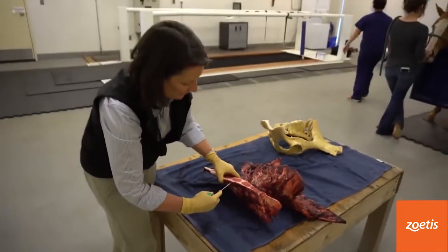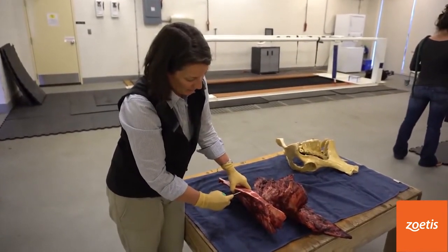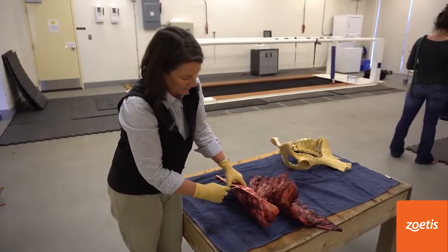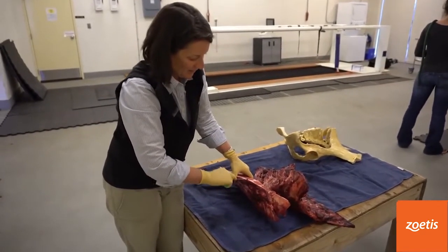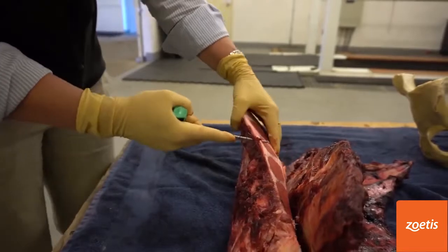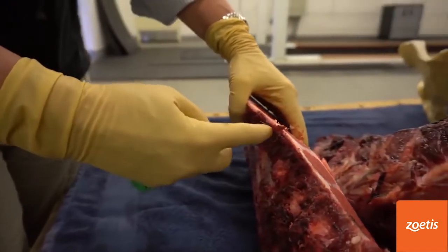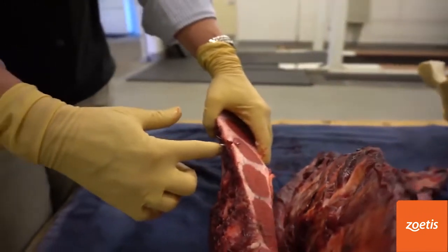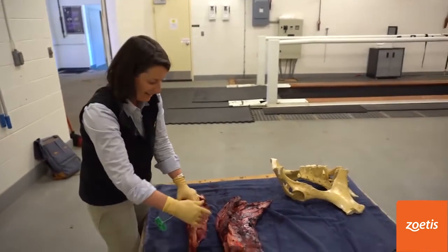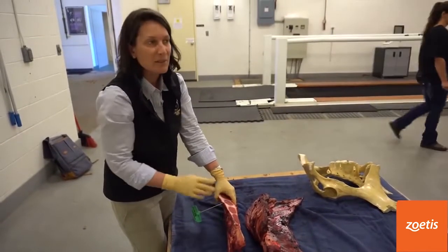When I get up to the surface of the sternum and rub back and forth, I'm making sure that I'm up against the bottom of the sternum, then I'm going to do my rotating motion and go through this cartilage. That's about where I'm going in — really only about two centimeters from the surface. You don't want to puncture into any internal organs, mainly the heart, so you want to make sure you're at this level and you'll get into the bottom third and still be very safe.